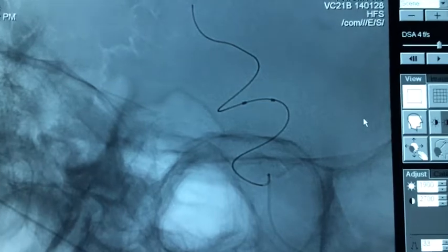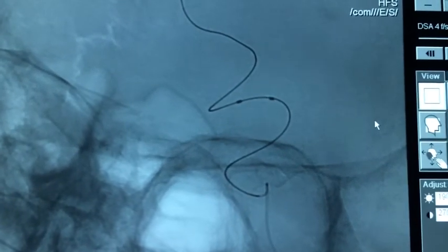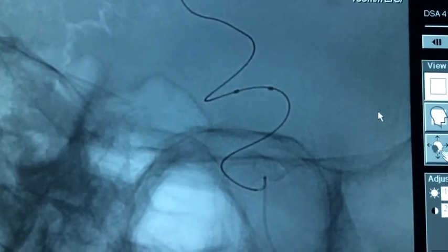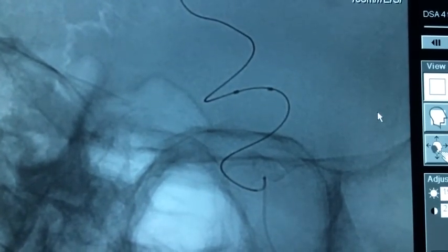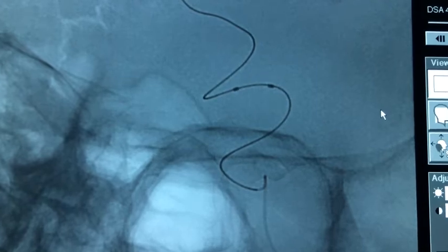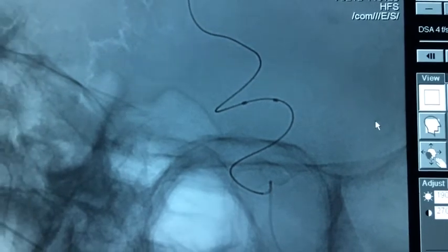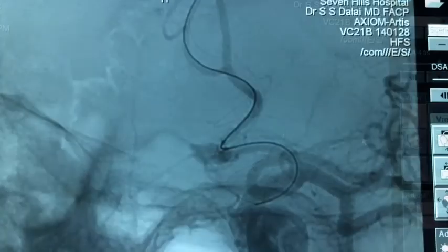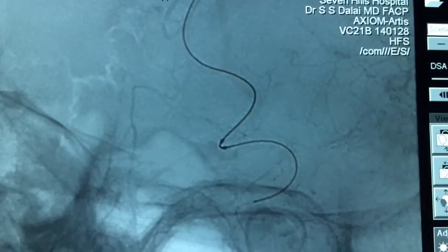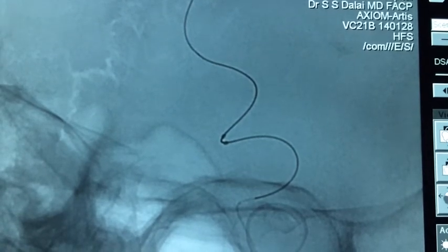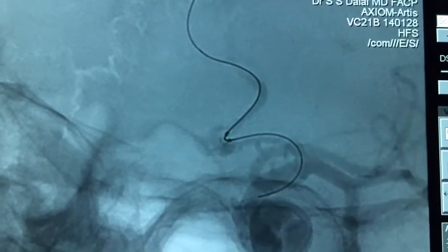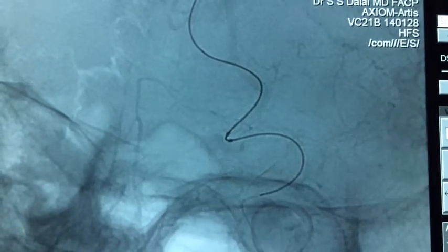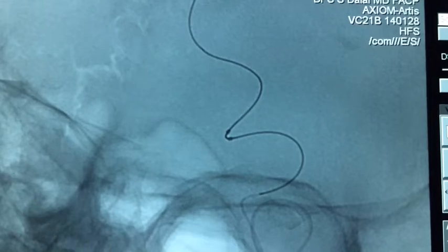We plan for balloon-assisted coiling. A Hyperform 4x7mm balloon has been navigated across the neck of the aneurysm. We can see the Hyperform 4x7 navigated just across the neck and placed right at the neck of the aneurysm.